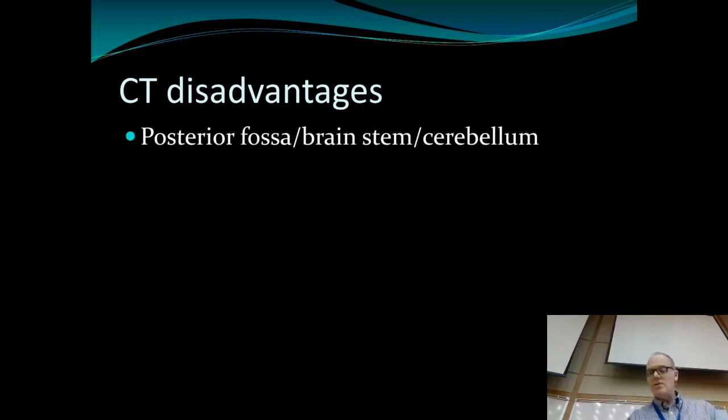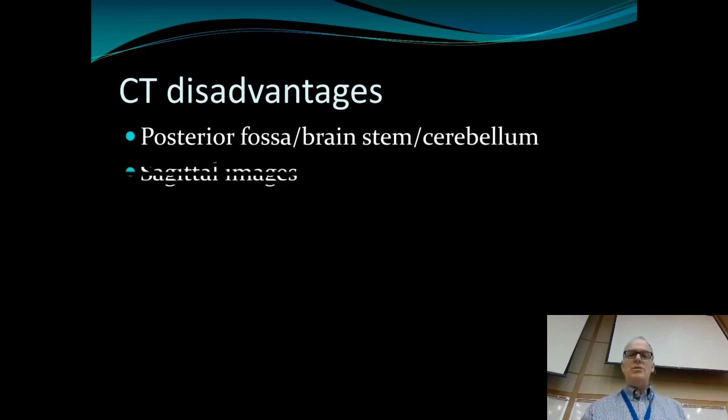Okay, so it's not very sensitive for something in the brainstem or cerebellum, with the exception that if you think it's a bleed, like you think the patient has a bleed in the brainstem or the cerebellum, then you would still do a CT. But for most other things, CT is not going to be that helpful.